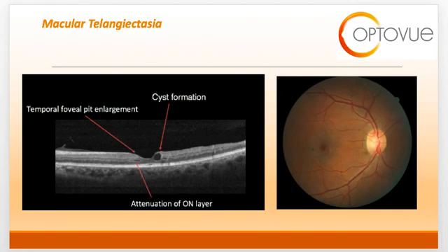Fundoscopically, MAC-TEL is characterized by telangiectatic vessels in the juxtafoveolar region, most commonly temporal to the fovea of both eyes. This condition may pose a diagnostic challenge when evaluated fundoscopically due to the subtle foveal findings.